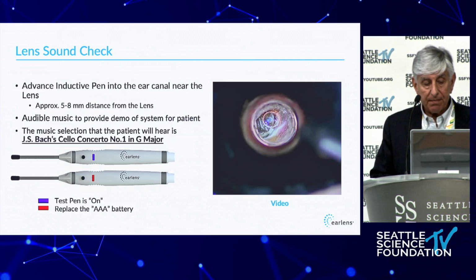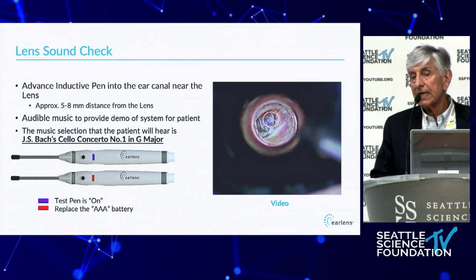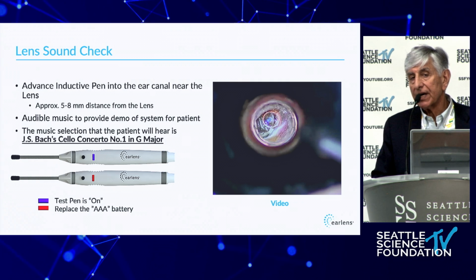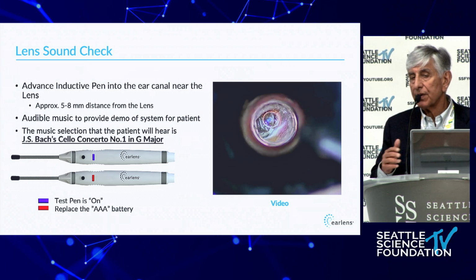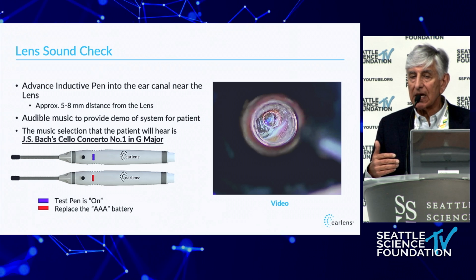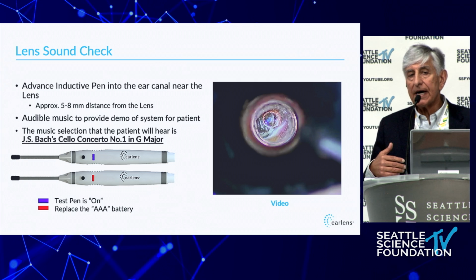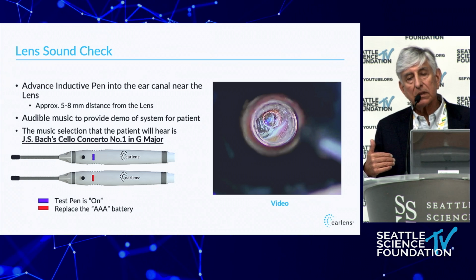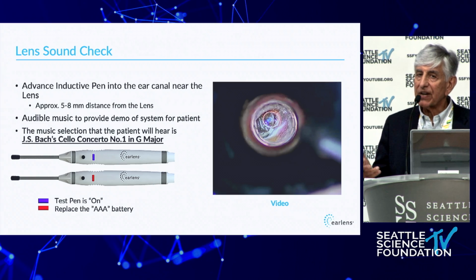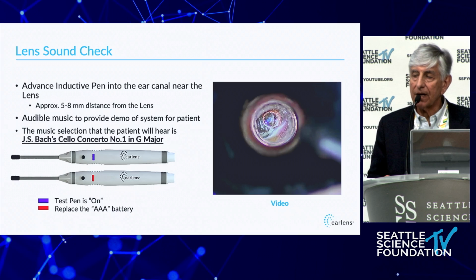Where does this fit in my practice? Just for those patients, like attorneys, people that need their hearing acuity as good as possible, people with a high frequency hearing loss who are really missing a lot of consonant sounds. One of my partners wears it who has a hearing loss. You do know it's in, just like a contact lens, but you tend to forget it because it's just like a little extra weight there.